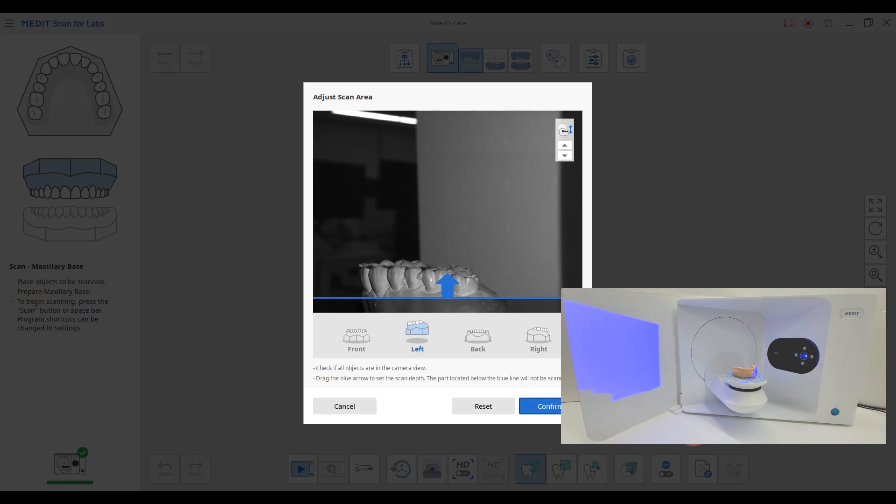Once you click the button, you'll see the Adjust Scan Area window to set the scan depth. The scanner will only capture the designated area.